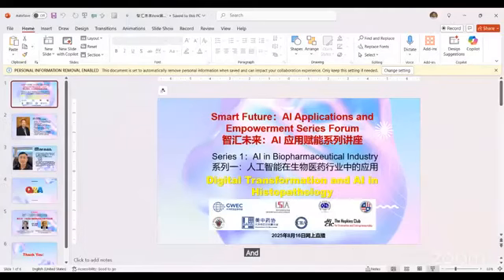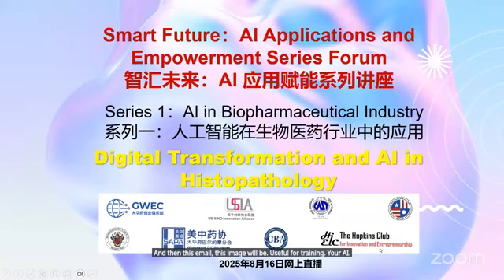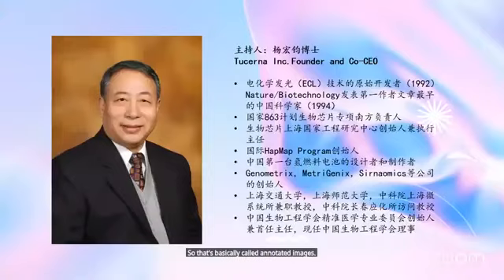So annotated images means that you have a whole slide scanning, for example, of a breast cancer tissue, right? That itself is just a regular H&E image. But annotated means someone, a pathologist, goes in there and can circle where the cancer is, right? And where the benign duct is, benign cells are, or immune cells are, or benign stromal tissue are. So that's called annotation. After you annotate these images, this image will be useful for training your AI. The AI needs to know what you think they are to learn. So that's basically called annotated images. Hope that answered your question.